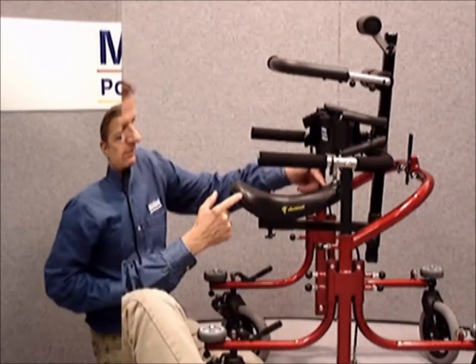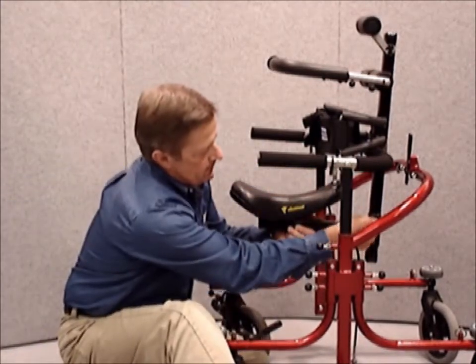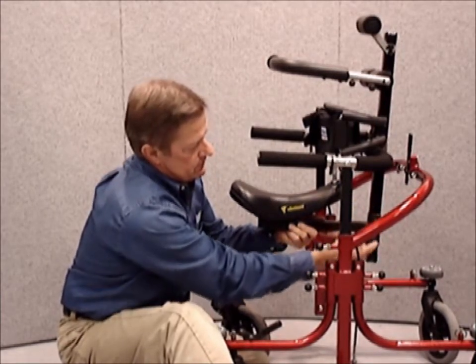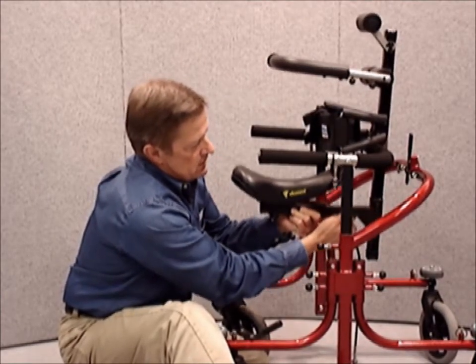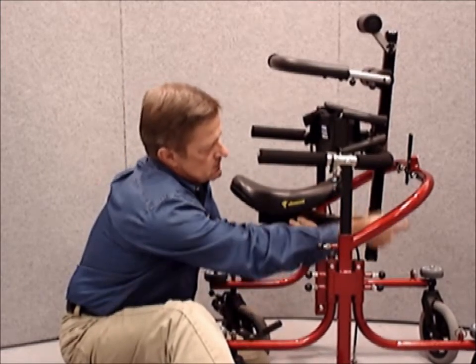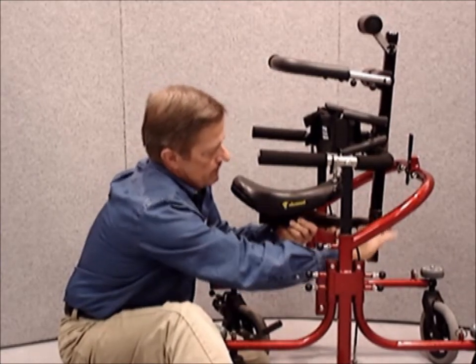To adjust the unicycle seat, we can change the height from the vertical column by loosening the 2 Allen head screws to the front of the seat. That will change the height up or down in fine-tuning. Again, once that adjustment has been made, tighten both of the Allen screws firmly.